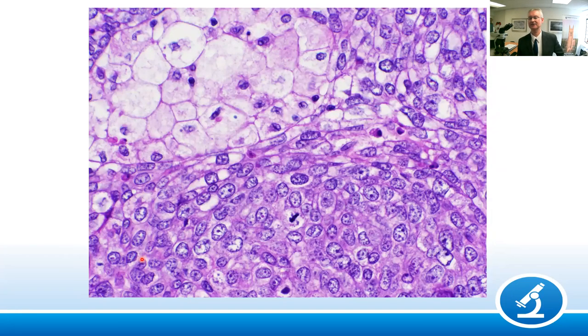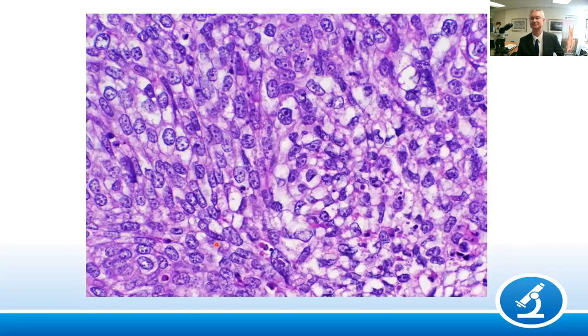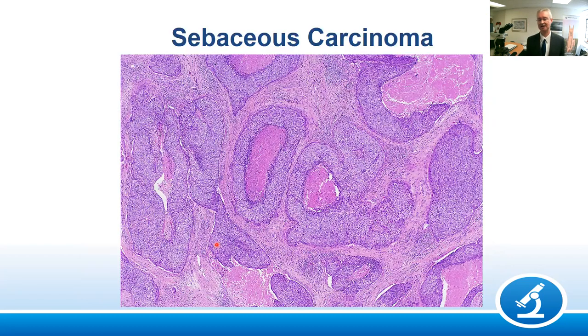And when you get the biopsy, you get this combination of sebaceous type cells, sebocytes, with higher grade cells and mitotic figures. Again, beware. Could this be a poorly differentiated basal cell or squamous cell or Merkel cell? Yes, and sometimes you need to do immunohistochemistry and tease these things out. Just like this comedo-type necrosis pattern is very, very well known in sebaceous tumors, like you might see in breast cancers. That's a good clue.